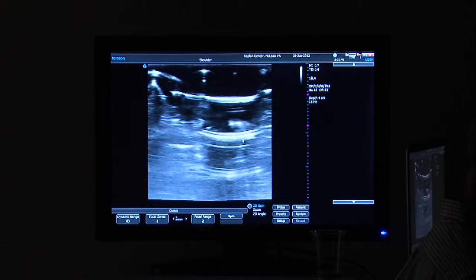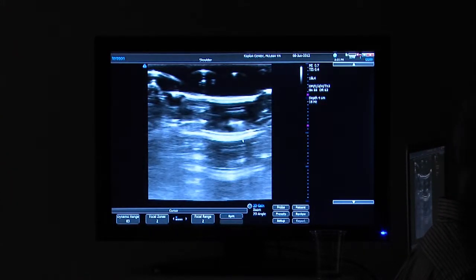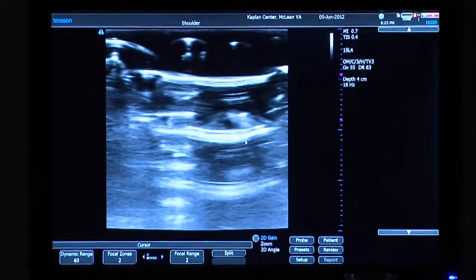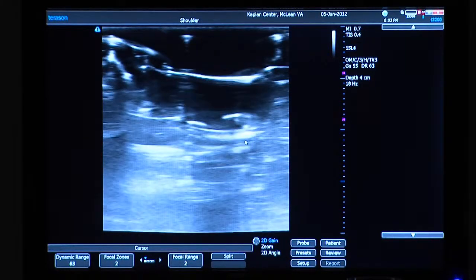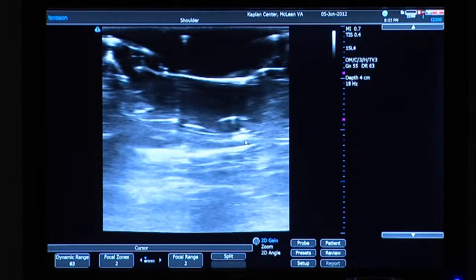Here we have our portable ultrasound machine. The technology is really quite good nowadays for more modest applications like musculoskeletal stuff — you can even do cardiac stuff with this too. I'm going to run through a general knee exam fairly quickly.